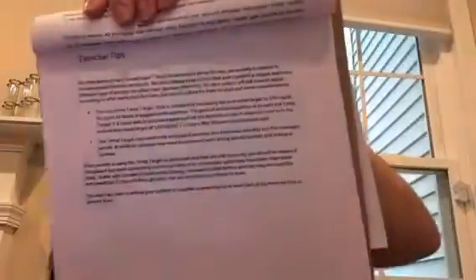With that said, let me get to the point — tip number one: exercise tips. I'm reading from the material. It says: 'We have learned many Smart Guard auto mode lessons along the way, particularly in relation to recommended exercise protocols. We must always keep in mind that every patient is unique and every different type of activity can affect their glucose differently, so each patient will still need to adjust according to what works for them — but here is a place to start and some considerations.'